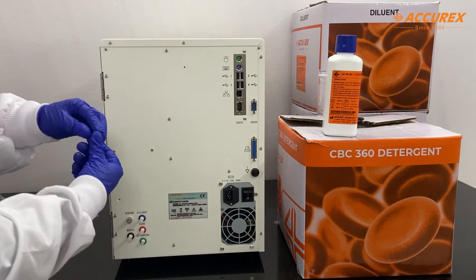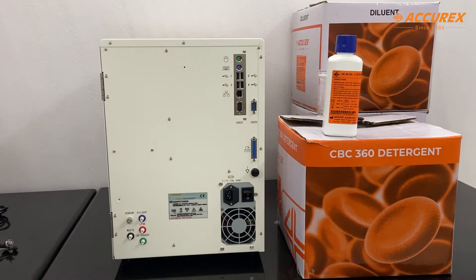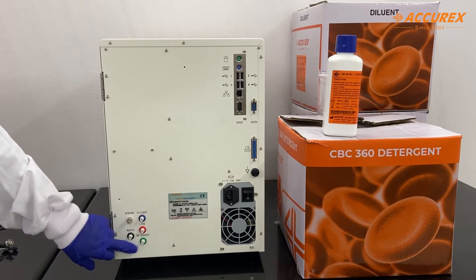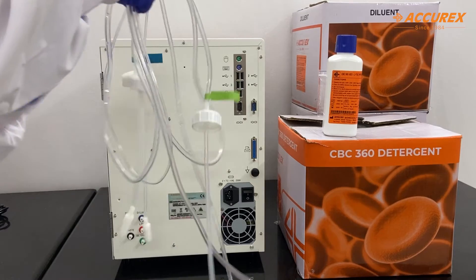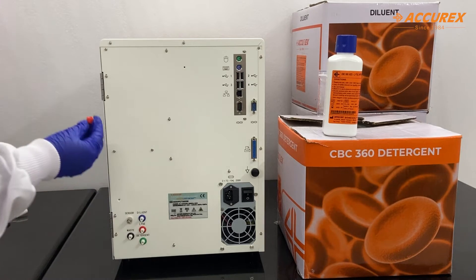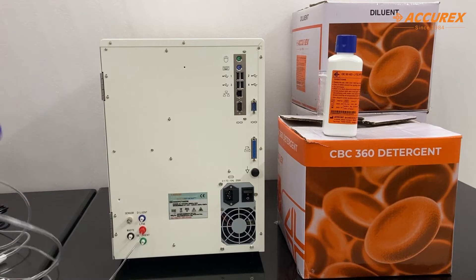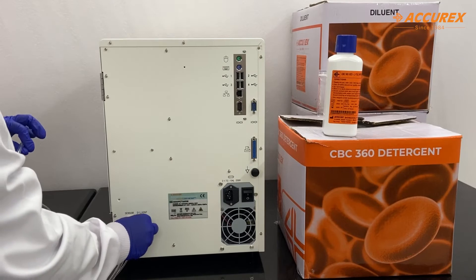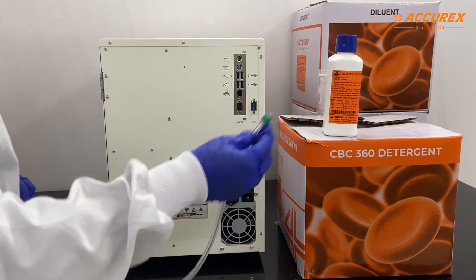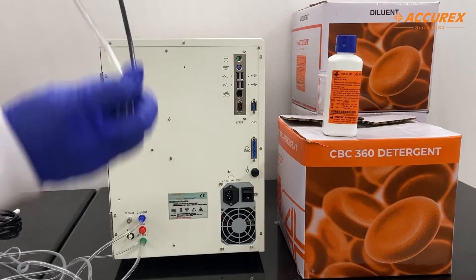We will remove these white tubes. Here there are different colors given: the blue one for diluent, red for lyse, green for detergent, and black for waste. The same colors are given on the reagent tube sets. The red one is for the lyse — you just connect it to the lyse. The blue one is for the diluent, the green one for detergent, and the black one is for the waste.